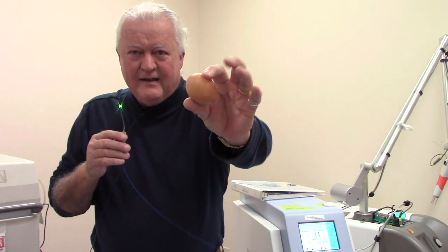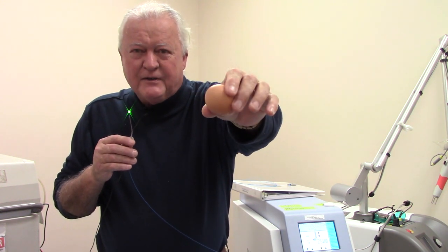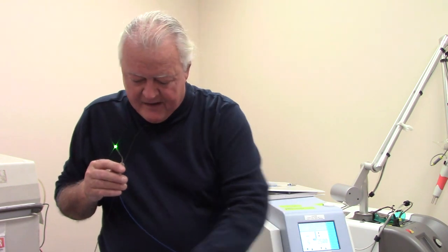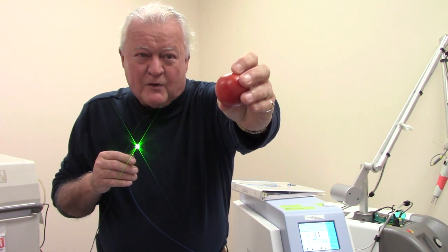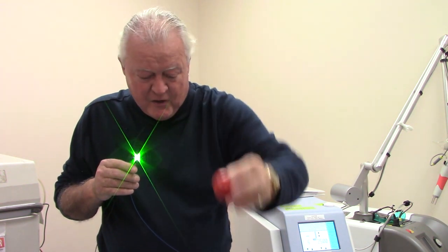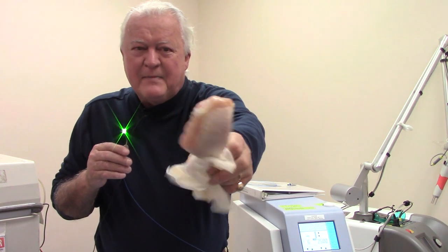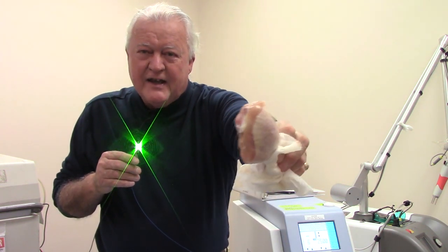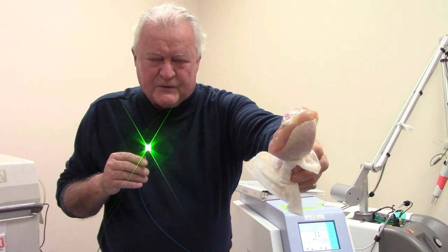So today we get to play with a few things here. We have a raw egg — let's see if we can break that eggshell without breaking the membrane underneath. Let's look at a small tomato and see if we can gently vaporize the skin off of it. Then let's turn to soft tissue and hard tissue. We have a piece of chicken here with meat, bone and cartilage, and you'll be able to see the different effects of high versus low energy and fast pulse rates.